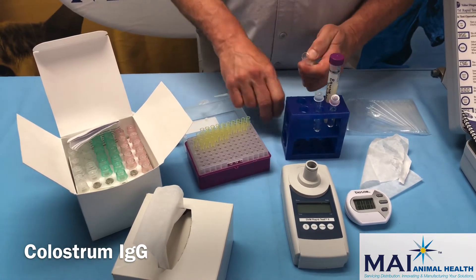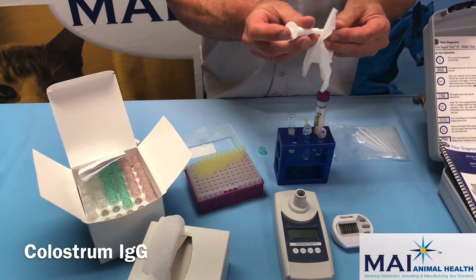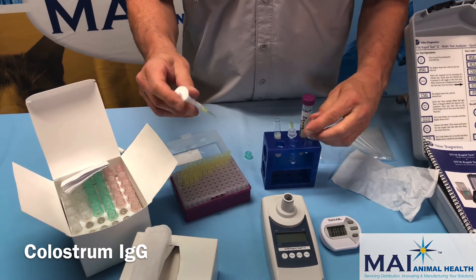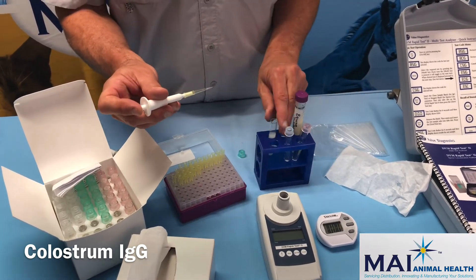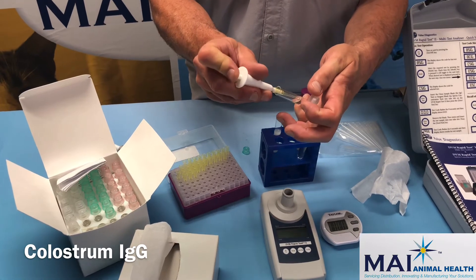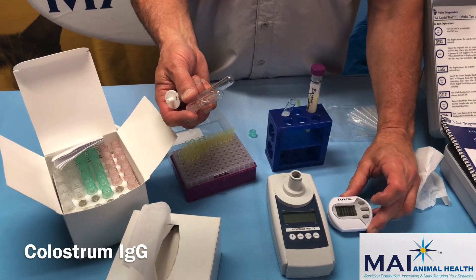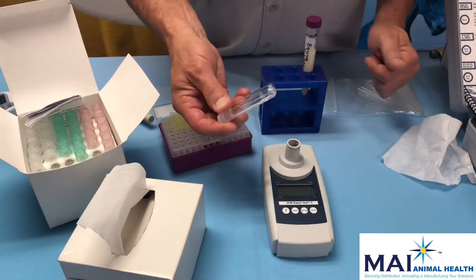Mix the diluted sample up again. This sample is then run just like a serum sample using the 10-microliter pipette — instead of serum, we're using this diluted colostrum. Take a 10-microliter sample, wipe off the outside of the pipette tip, do the blank tube first and rinse out the pipette tip, then get a new tip, add a new sample, add the sample to the reagent tube rinsing up and down, mix the tubes five times, and start the timer for 10 minutes.